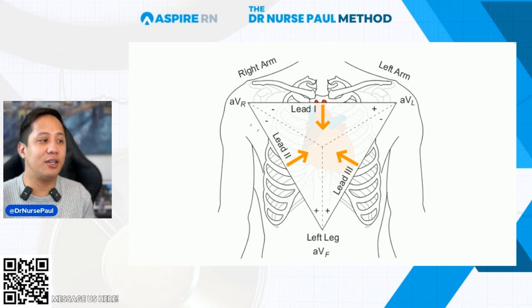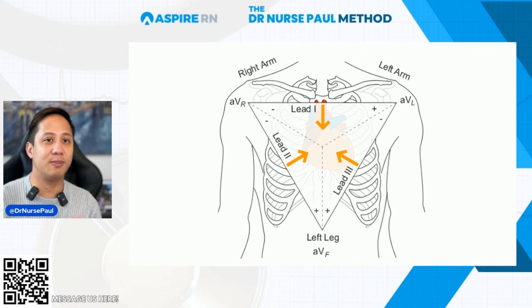There's no condition that correlates to aVR. When you have a right atrial problem, you probably have a right ventricular problem as well, because both are connected to the right coronary artery. Cut it short. Don't worry about aVR.